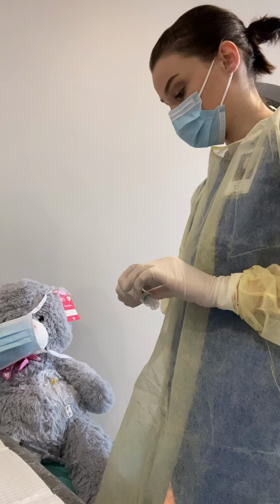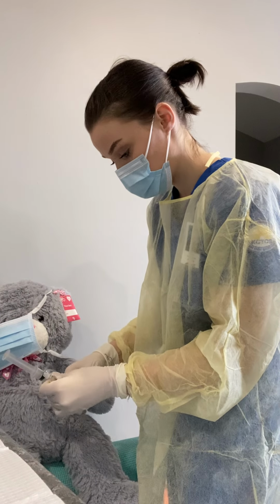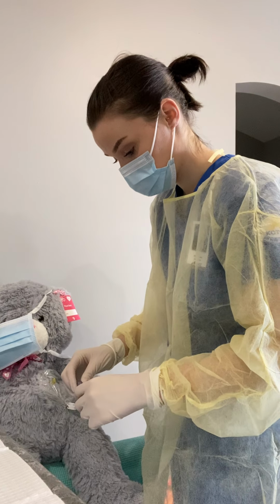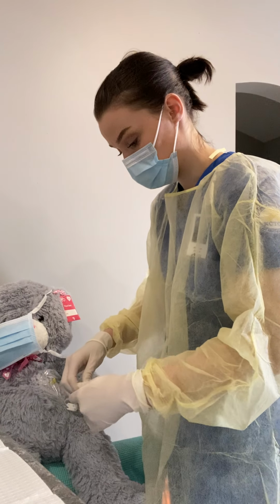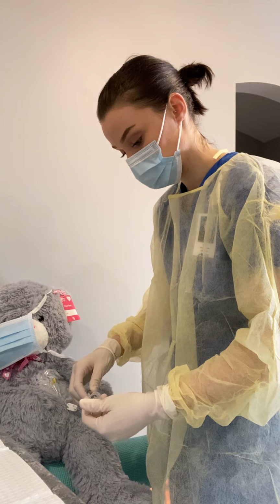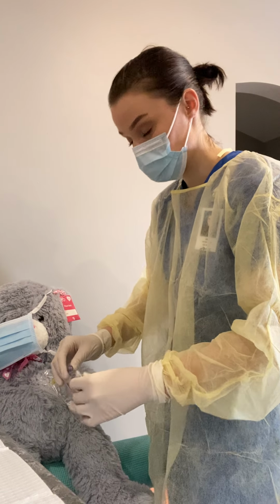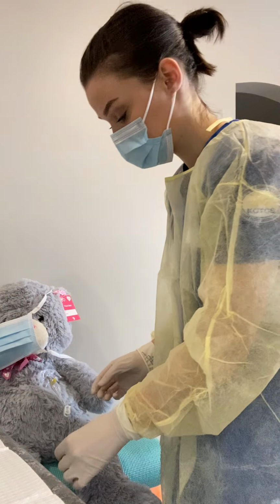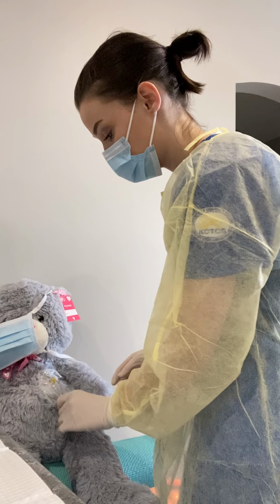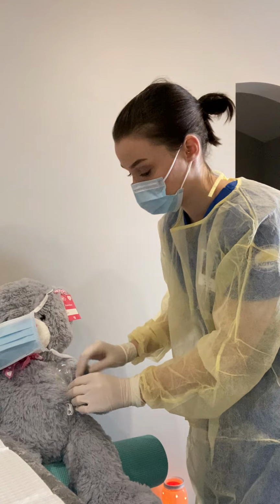I'm going to get my heparin. And I'm going to connect my heparin. We verified placement. Get that heparin connected, and I'm going to put the heparin in the line. Okay, so we've got the heparin in. Perfect. Okay, so now that that's done, I'm going to reclamp the tubing. All right, and then we're going to pull the dressing from out to in. Hope you guys can see.